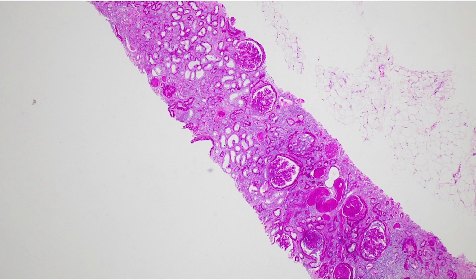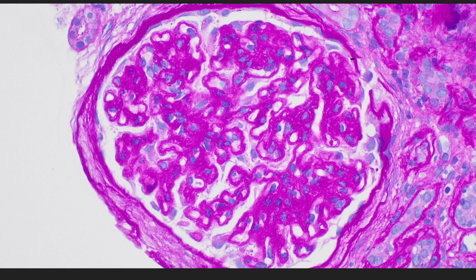So here we have a medium power of our cortex, again showing severe chronicity, some globally sclerotic glomeruli, and some dilated tubules. Were there any glomerular changes? So here we have a picture of our glomerulus. We can see that there's some mesangial expansion. We also have quite thick and rigid capillary loops.